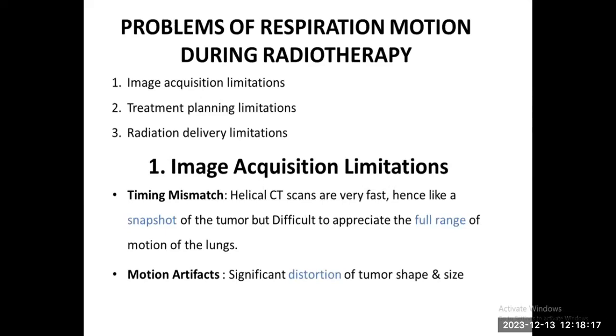So there are three places where we observe these kinds of issues and artifacts. Radiotherapy most of the time starts from diagnostic imaging. Diagnostic imaging can be CT, MRI, and PET CT. So the first part is image acquisition limitation.